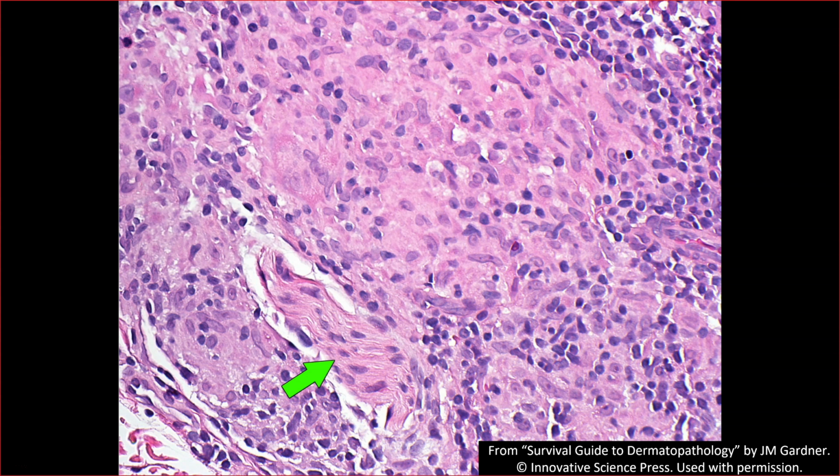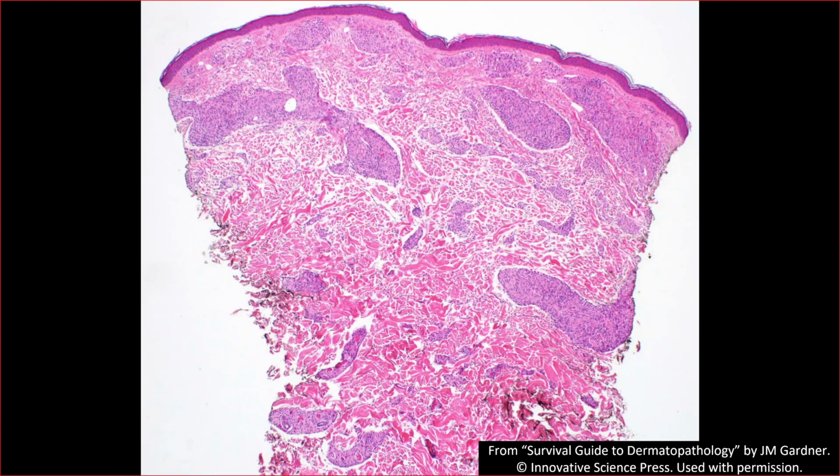And that was the basic approach that was given to me by a leprosy expert, actually, who has seen many, many cases, who said that that's how they deal with it when they've done the Fite stain and it's negative, and they've done molecular and it's negative, because sometimes in tuberculoid leprosy, the organisms are so sparse that you can't see them, and even molecular won't be able to detect them because they're so rare that there's just not enough nucleic acid there to amplify.